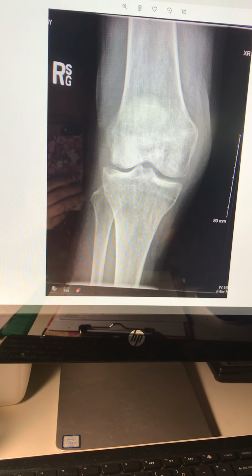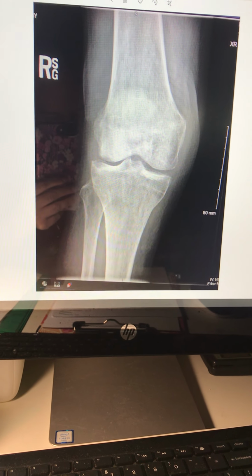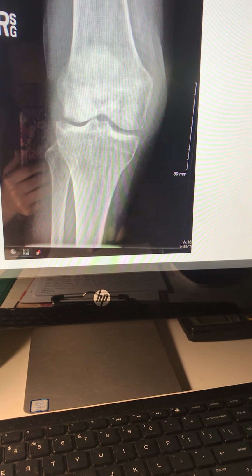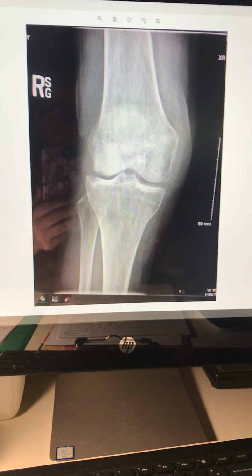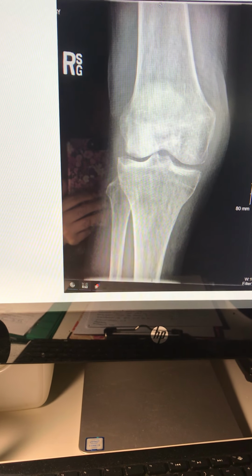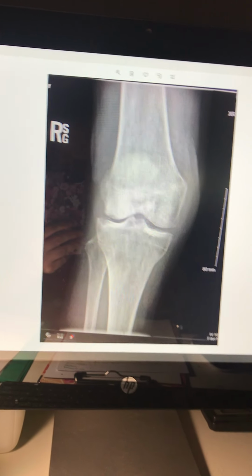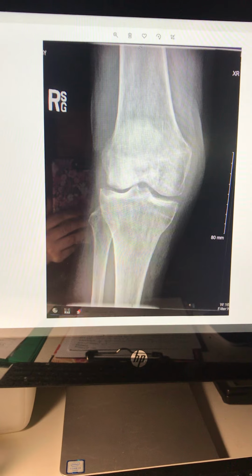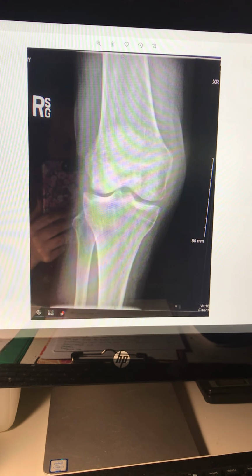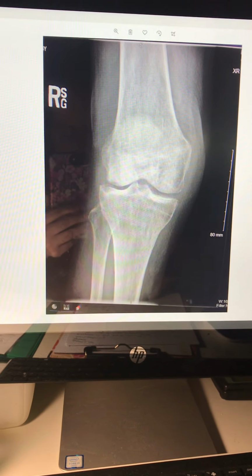The National Osteoporosis Foundation recommends having bone mass density checked for these reasons: if you're a woman 65 years or older, postmenopausal women younger than 65 with the risk factors that they list, and postmenopausal women who break a bone when doing a normal task. It just breaks easily, so they should get tested. The test is a DEXA scan, the dual energy X-ray absorptiometry. It measures bone density. The test uses low energy X-rays and compares the density of the patient's bone to a 30-year-old of the same sex and race.